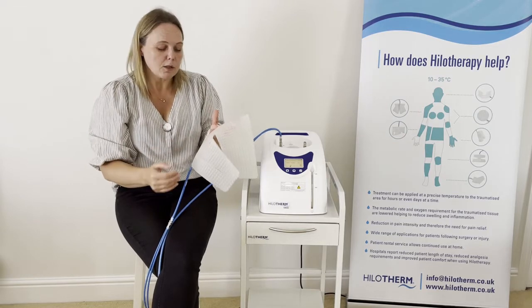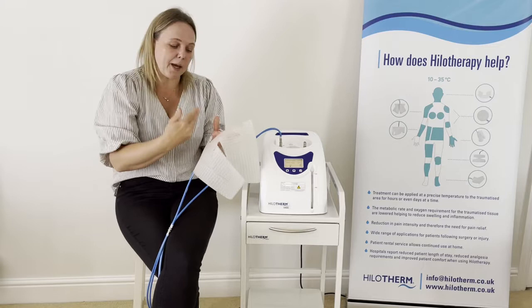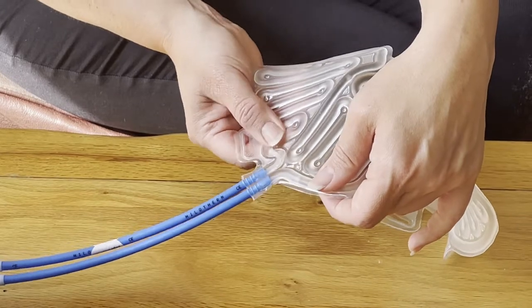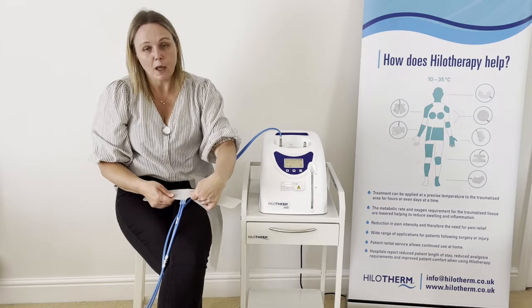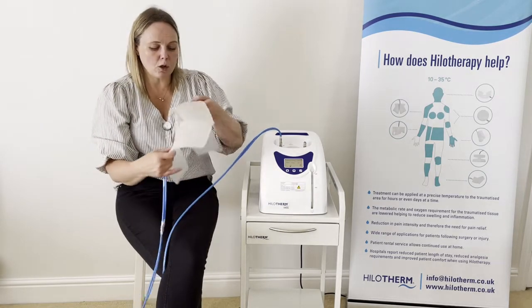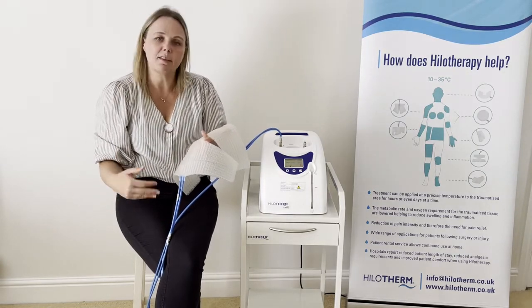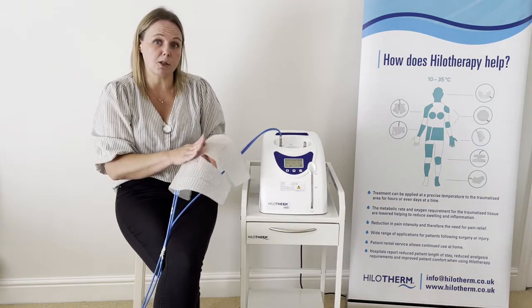You just need to make sure that there isn't any strapping or that the patient isn't lying on the cuff, stopping the water from flowing all the way around. One way to check this is to feel near the blue input and output tubes to make sure both feel inflated. If not, take the cuff off the patient, lay it flat, and make sure the water is travelling all the way around before carefully refitting it.